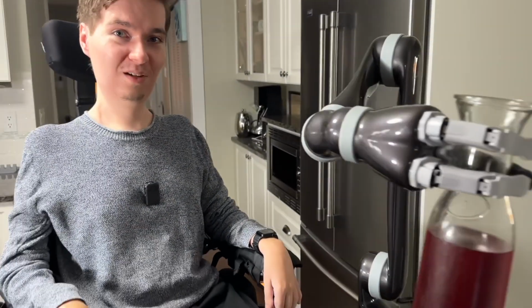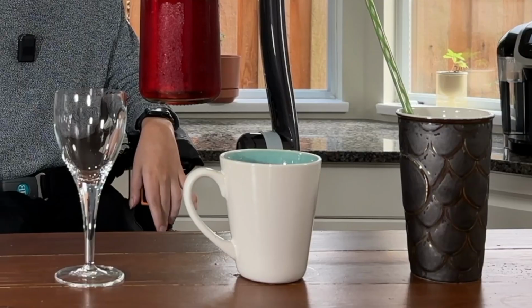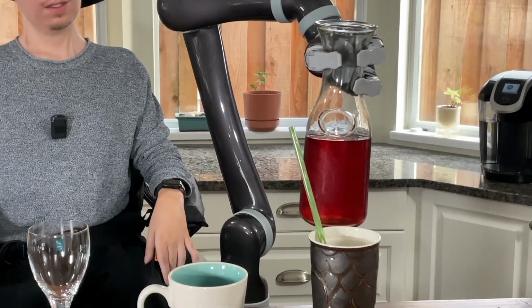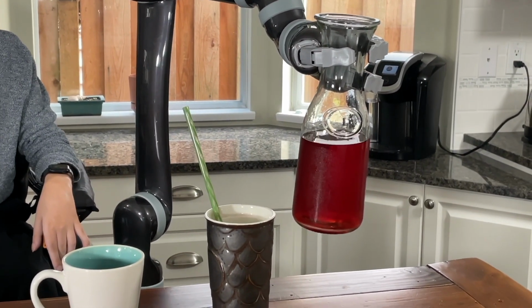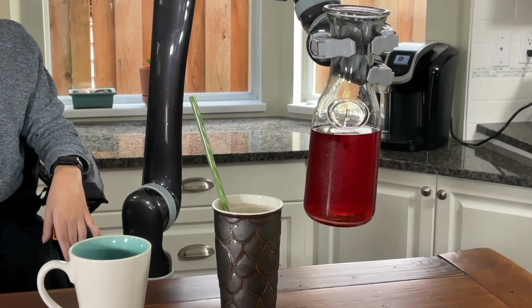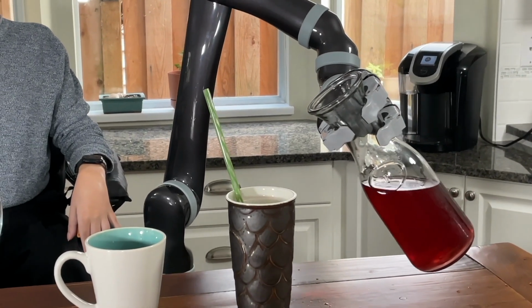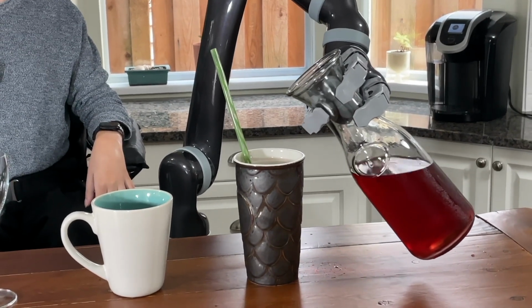Now let's pour ourselves a drink. Pouring your first drinks with Jaco is a very simple task, but let's just ensure that we're doing it slowly, especially for our first couple of times. So I'm going to move my drink all the way over here to the side, and I'm going to adjust the angle of the hand just a little bit, and then I'm going to go into B2, which is going to be our primary mode for pouring these drinks. So I can see that I'm a little bit too far away from the cup, so I'm going to move in a little bit closer, and this will be something that you get better at with practice, so that's okay.